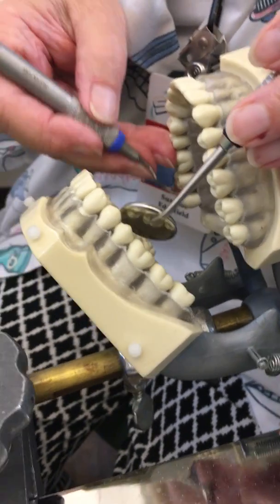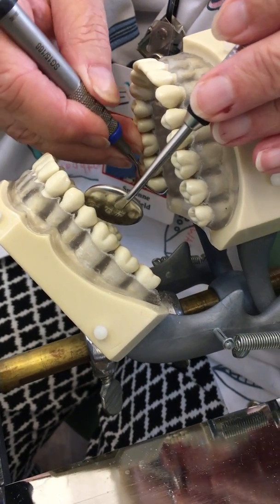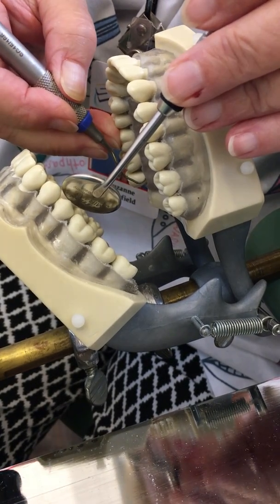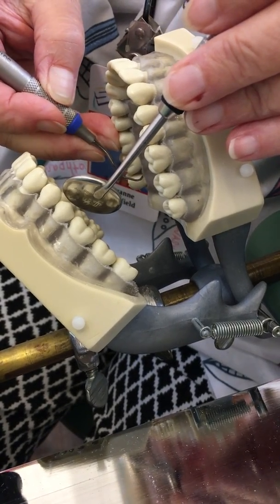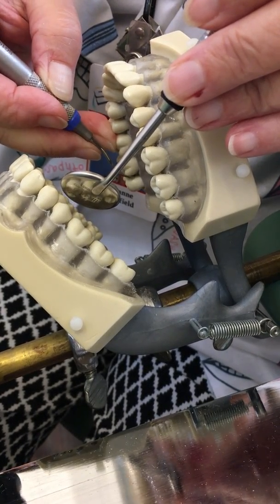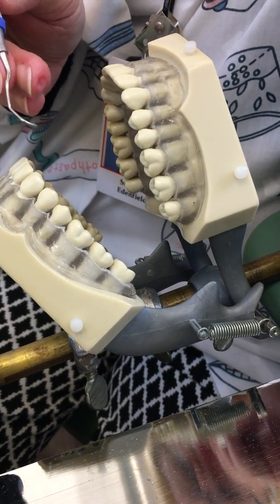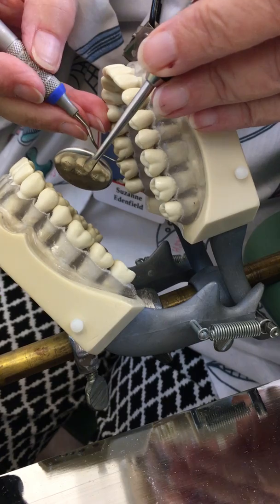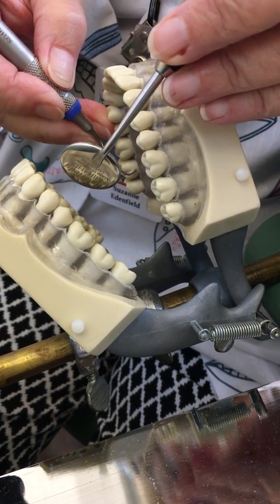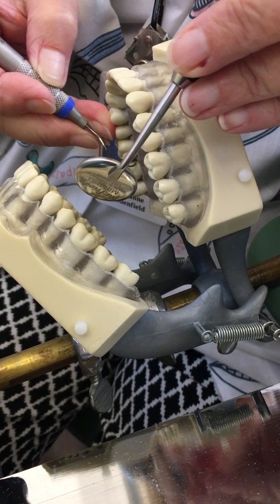With these instruments, when it's wrong, it's really wrong. Go in closed and open. Oblique strokes across the lingual and vertical on the proximal. My fulcrum is piggybacking my second finger, and that forces really all of my fingers together as I'm doing my strokes.